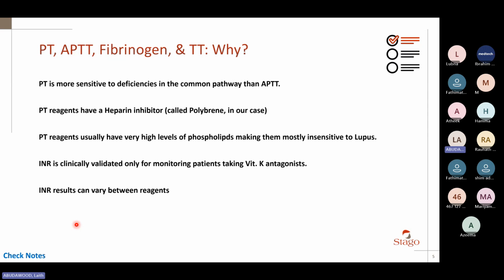But my point is, some studies have reported that if you compare a recombinant reagent to an extraction reagent, you might see differences in INR in some patients depending on the patient status, especially in the first days when the patient starts to take the warfarin therapy. So if my patient is within, let's say, the first 5 days or first week of starting warfarin therapy, and I compare the results between recombinant and extraction PT reagents, you will see significant differences in INR. Actually, it's not recommended to monitor INR in the first few days of warfarin therapy. This is one of the reasons.